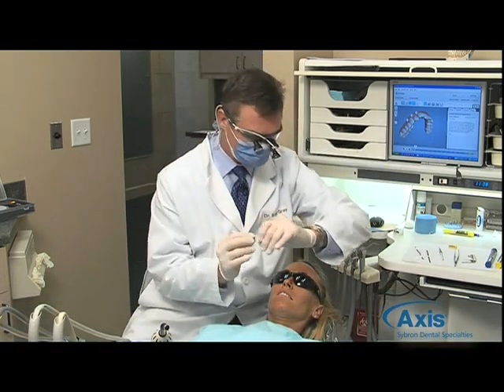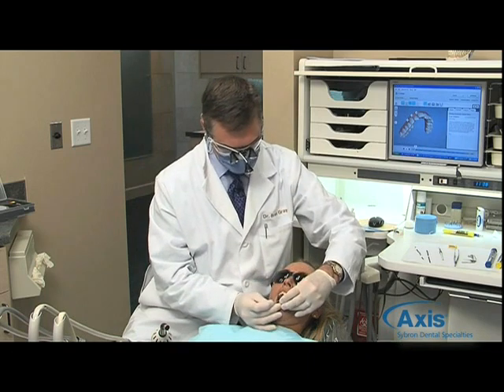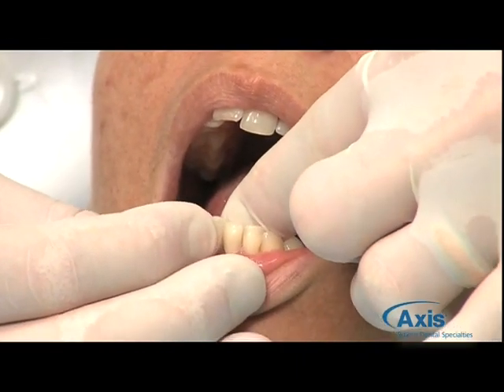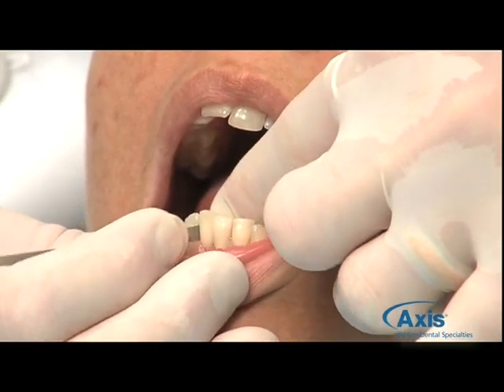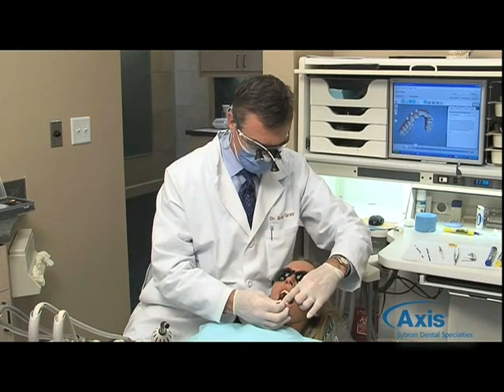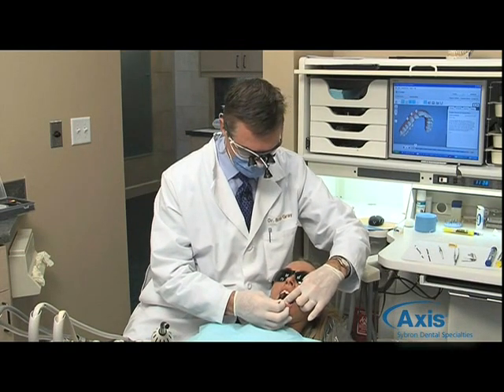We take the yellow strip to begin with and carefully slide it between the open contact, working it back and forth. We can begin with the smooth part of the strip to get it between the teeth, and then use the abrasive side to reduce the tooth structure.